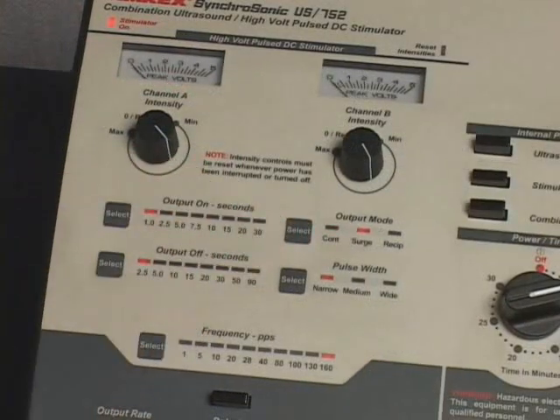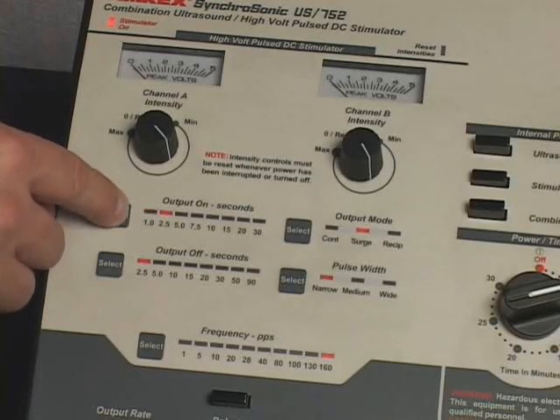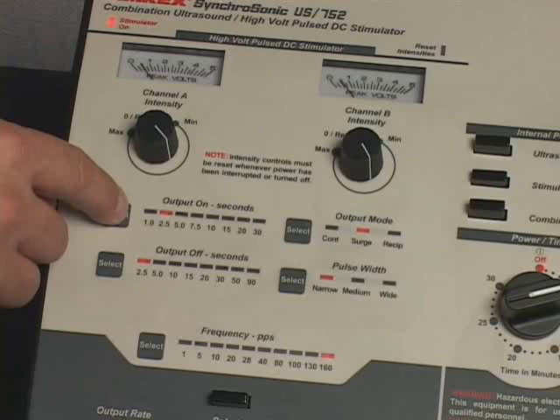Press and release the Output Mode control to select the continuous, surge, or reciprocal output mode. The Output Mode indicator light array will indicate the output mode selected. The output mode can be changed at any time during treatment. Press and release the Output On control to select an output on duration for the surge mode or a reciprocal output on duration for the reciprocal mode. The Output On indicator light array will indicate the output on duration for the surge mode or the reciprocal output on duration for the reciprocal mode. The Output Rate indicator lights for Channel A and Channel B will reflect the output on duration selected. The Output On control is disabled in the continuous mode.